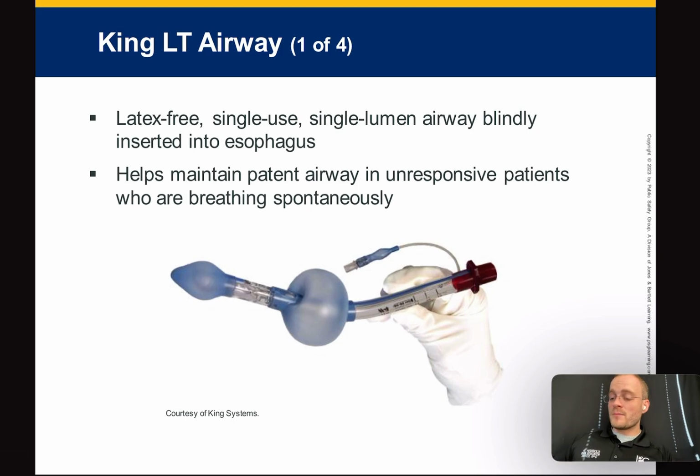Now, this last part, I'm going to buzz through it because this is more so assisting paramedics. And if you want to end the video now, you can, but it's going to take like 3 minutes. But these are devices that in Texas, you can put in. But in the National Registry, you cannot as an EMT basic.